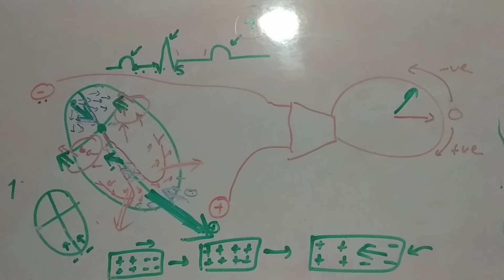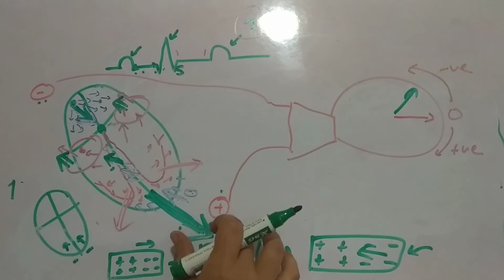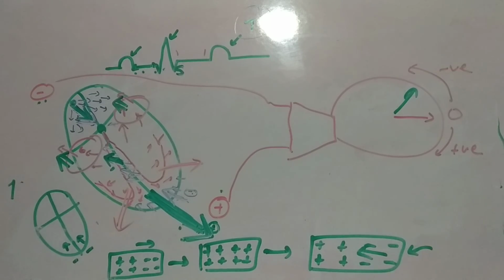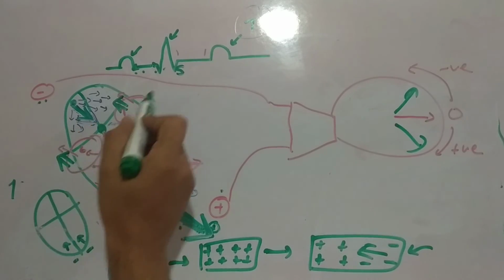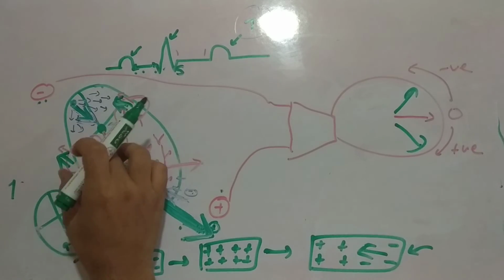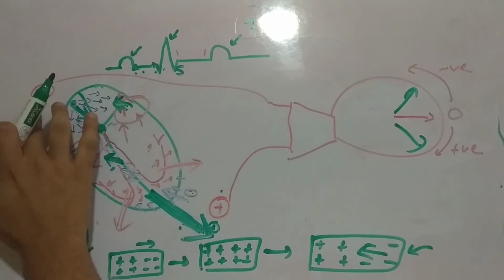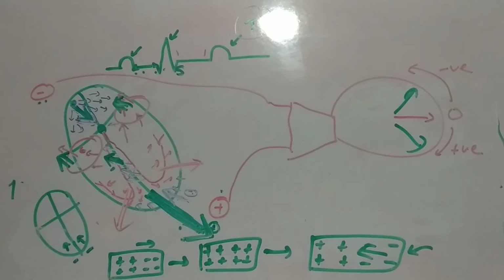And when the resultant vector of ventricular depolarization is taken into account, the positive vector will be moving towards the positive electrode, so the deflection will be positive in case of ventricular depolarization. The S wave is the basal portion, where a little bit of ventricular depolarization remains to take place, and this positive vector is moving towards the negative, so here the deflection is negative.